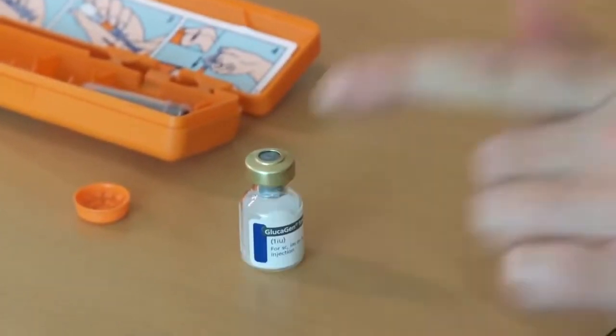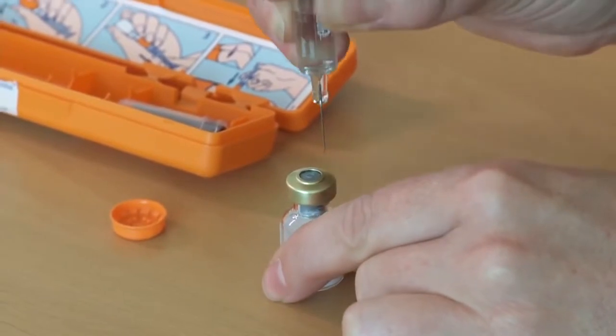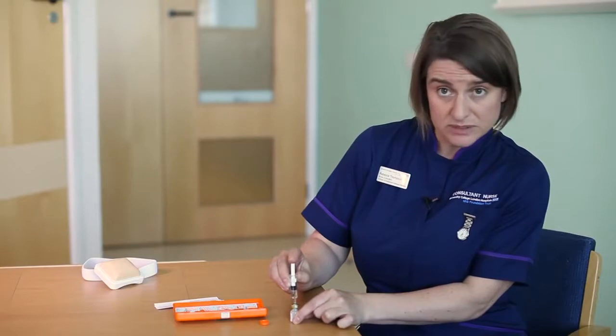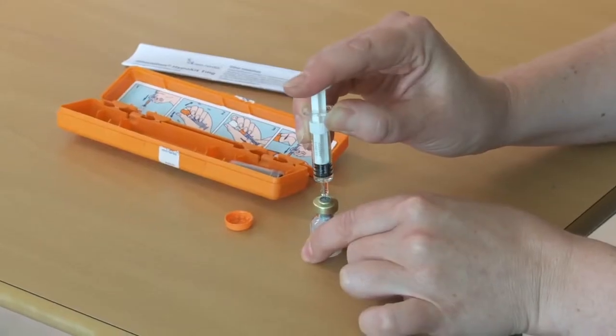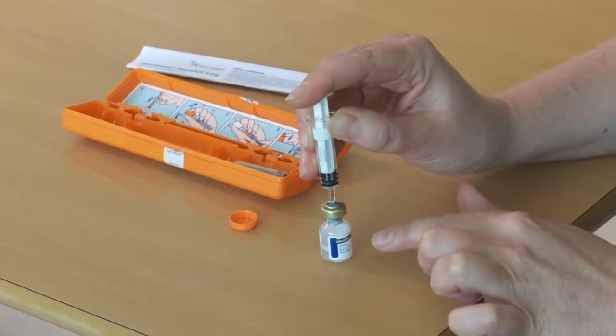Holding on to the base of the vial so it doesn't slide, I'm going to put the needle through the bung on the vial. I'm going to put all of the water in the vial. And then we need to wait until the powder is dissolved.